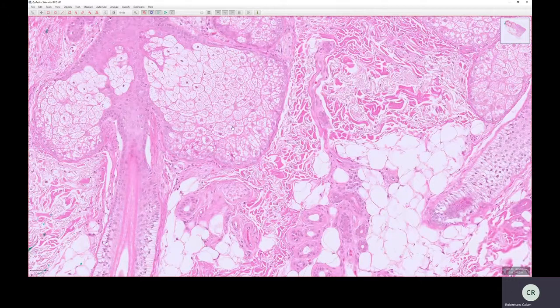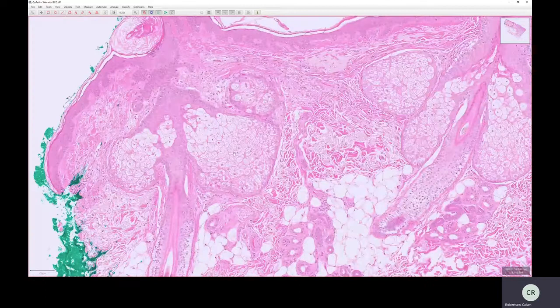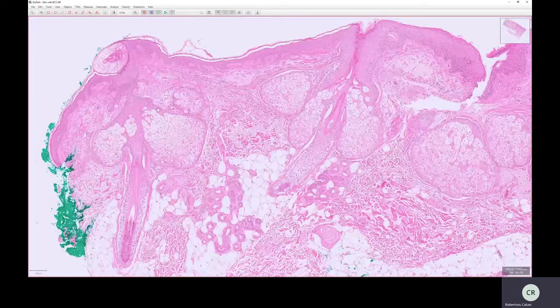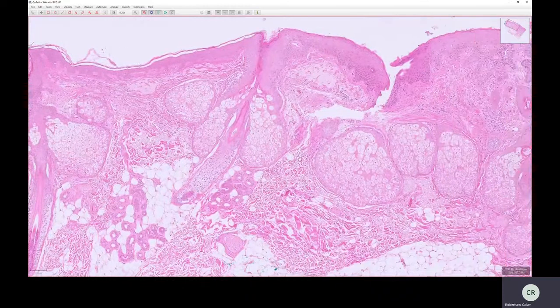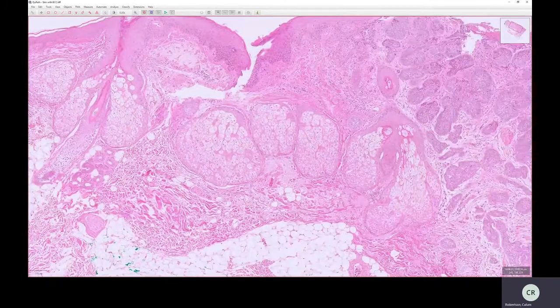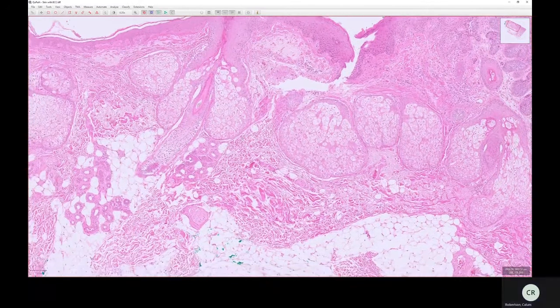These are the sebaceous glands, and they're producing sebum, which is the oily stuff that gets secreted from sebaceous glands that you can see on your skin surface. This is probably from someone's face, or head and neck, because it's got quite a lot of sebaceous glands here, which we wouldn't see, for example, in somewhere like the forearm. So these are two different types of glandular epithelium.